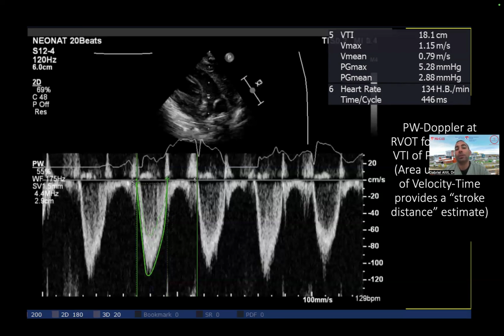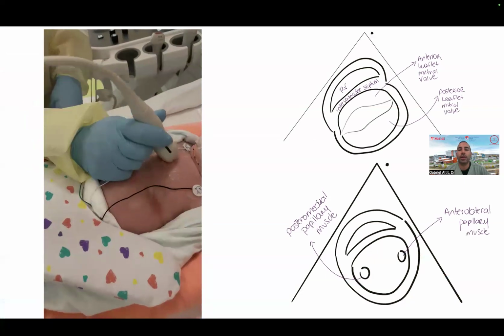That's number one. Sometimes you can get a very nice RVOT view from the apical area if you do an RV three-chamber view, or even from the subcostal when we do that anterior sweep, or we could do that TED view and be best aligned. And sometimes the best alignment is about motion of the probe to really be en face of the valve. Sometimes you need to move your probe to actually be in front. It's the same thing with TR: to get the best TR, you always need to have the least angle of inclination.